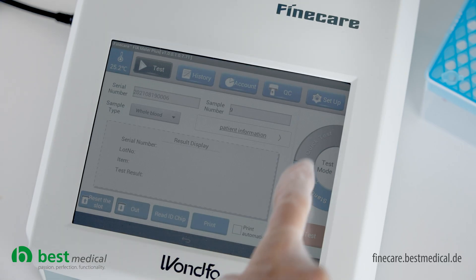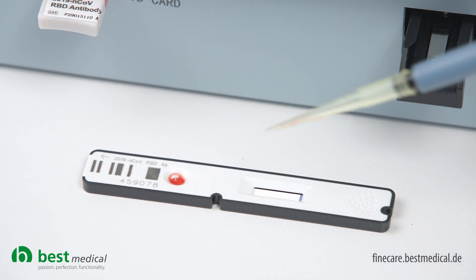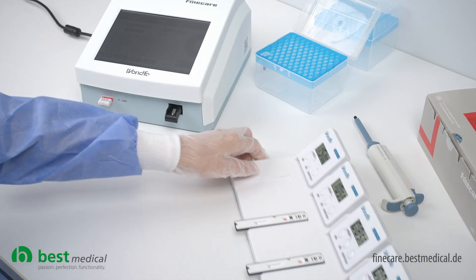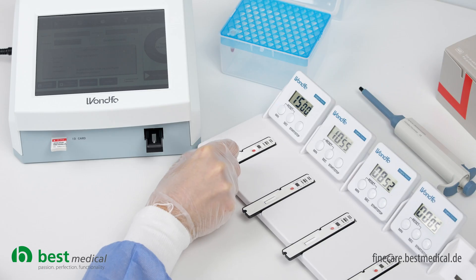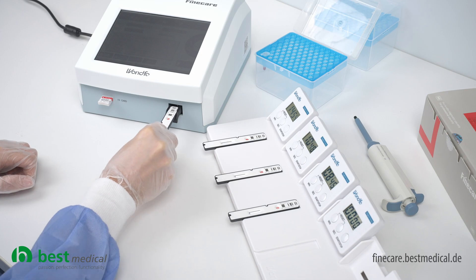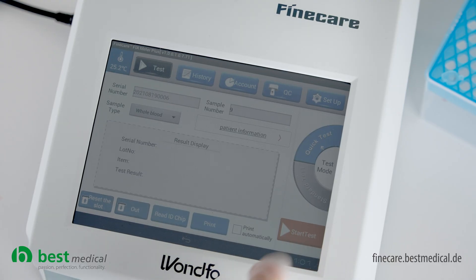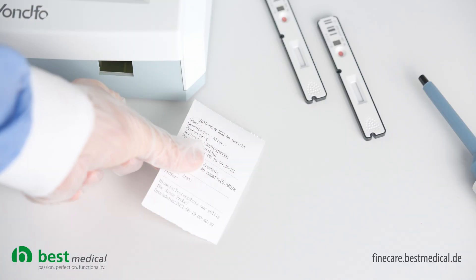You can also switch the FineCare Plus to the quick test method. To do this, store the test cassettes on the storage stations supplied with the test device. Set the timer, also supplied, to 15 minutes and remove the test cassettes from the storage station after the timer has expired. Now perform the quick test in the same way as the standard test. You will receive the test result after a few seconds and can perform several tests in succession.